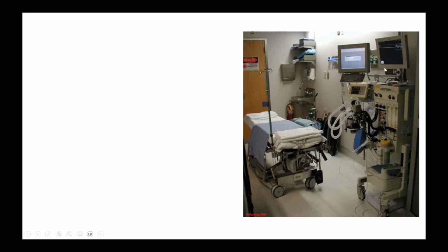You can see here, this is your regular monitor which you are using, and this is the AIMS software and hardware. And this is the monitor screen where you can see the parameters getting transferred from the monitor, right from the fresh gas flow you are using to the concentration of the volatile that you are using, and you can see there is a keypad. So if you want to manually enter something, you can always type and include the time, and that will also be included. So automatic recording will be there.